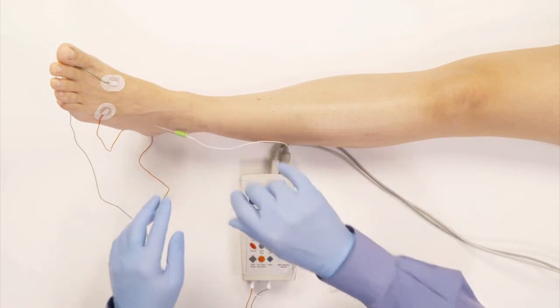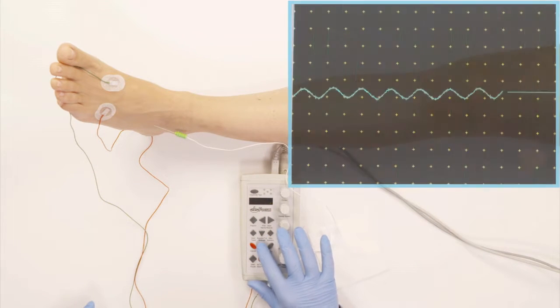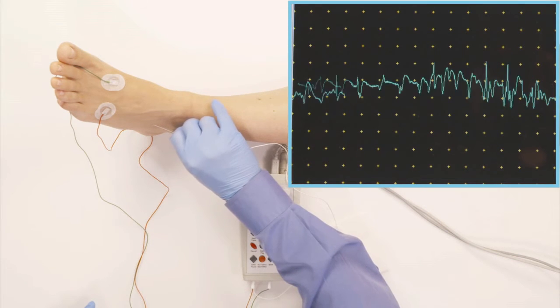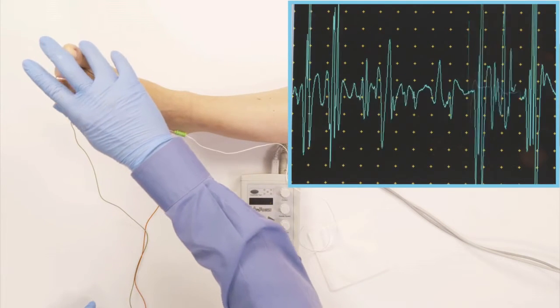Stick, and now I should be inside the muscle. And I'll put this, and there's a little bit of artifact, but that's normal, some electrical artifact.